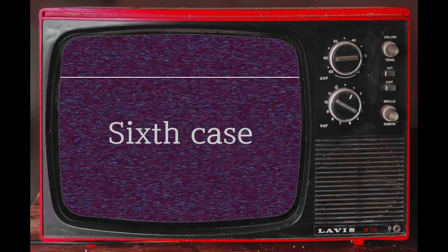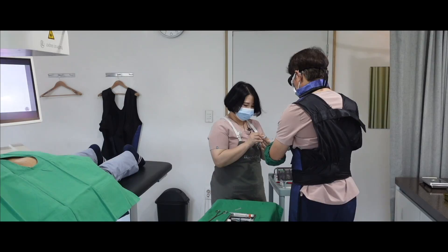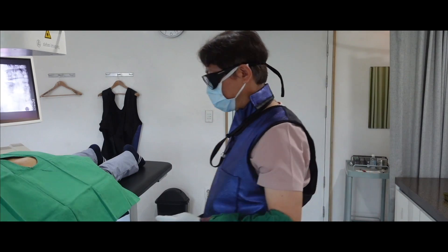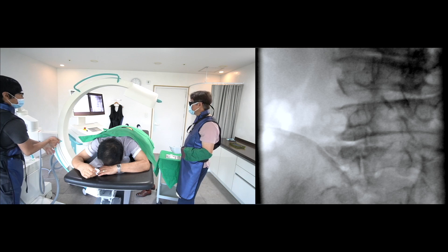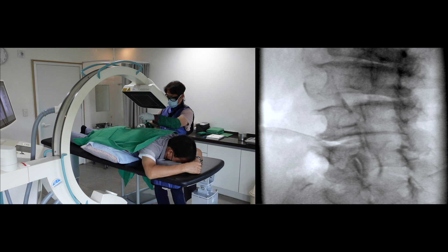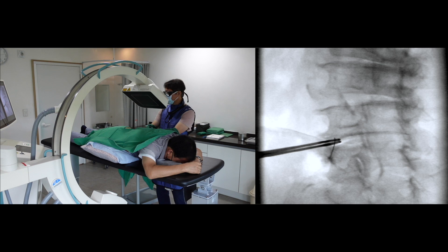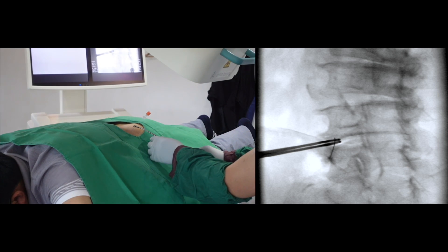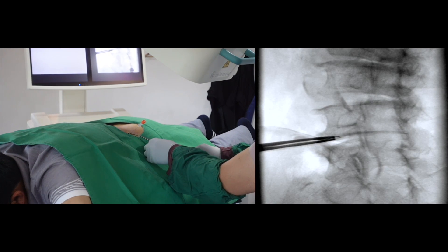Let me present the sixth case. It is a case of left L4-5 severe foramenal stenosis. I'll deliver the steroid mixture into the left L4-5 foramenal space with botulinum mixture into the L4-5 facet joint. Please note the C-arm angle — it shows caudal angulation to align the inferior end plate of L4.